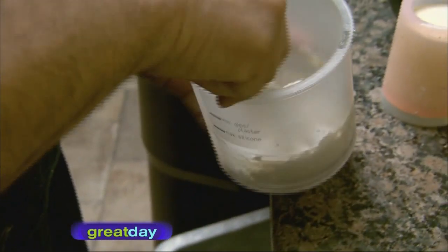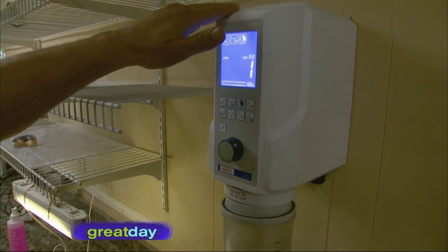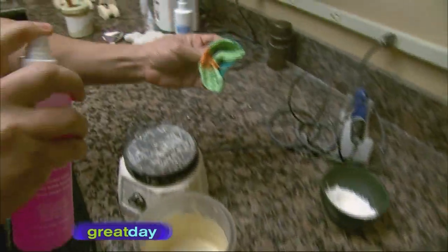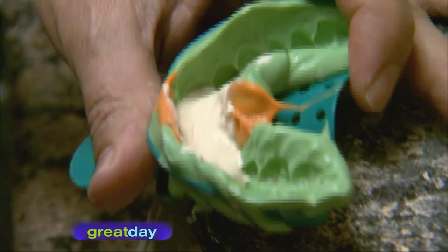The dentist first prepares the tooth for the crown. An impression of the tooth is taken to record the shape — this is all done in the patient's mouth. Once that impression is taken, it is boxed up with the bite registration and sent to the dental lab for the process to begin of how a crown is born.